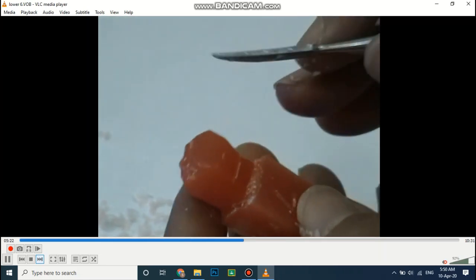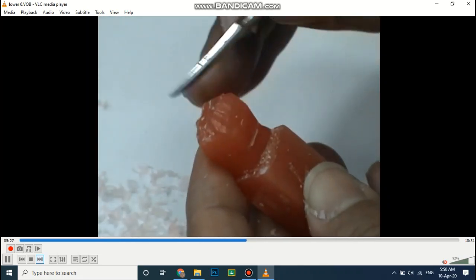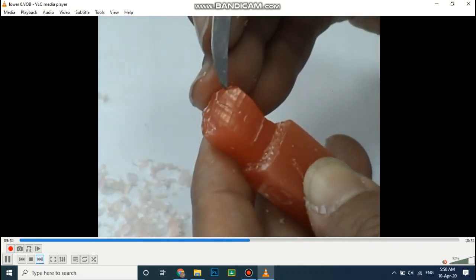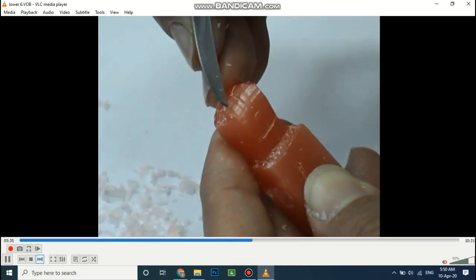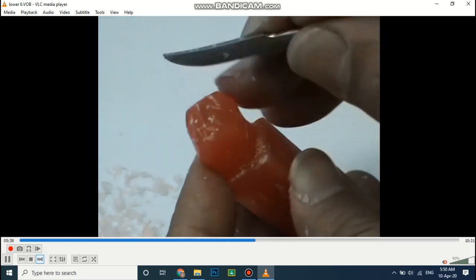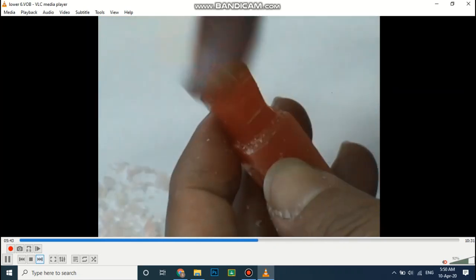Lingually, even separation occurs. A central line is drawn, just 2 mm. Each cusp has a central cusp tip. From this cusp tip, connect with the 2 mm separating line.